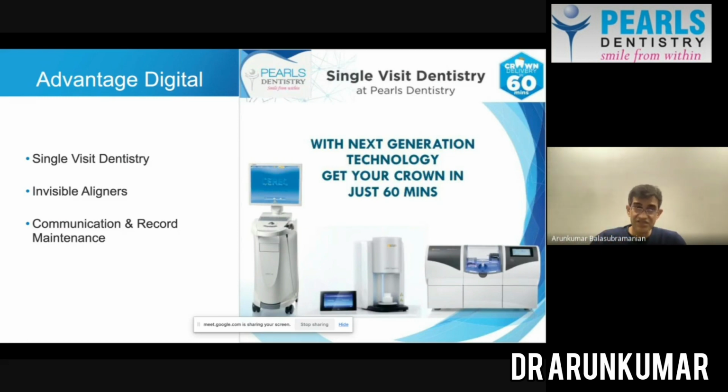But with digital dentistry, that entire two-sitting process can be done in one visit, where we not only make an impression, we also make a crown, a zirconia crown, that is very accurate, durable, and long-lasting within 60 minutes, and then be able to fix it. So that's what single visit dentistry is all about. That's the advantage of digital dentistry.